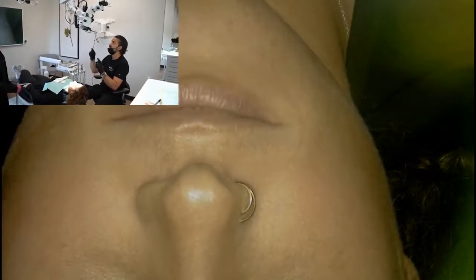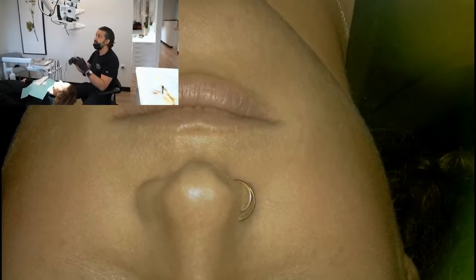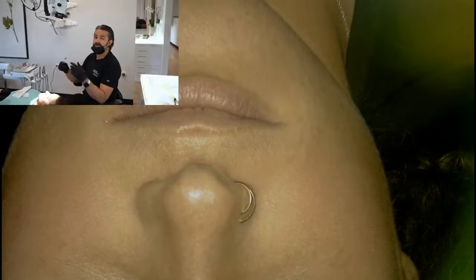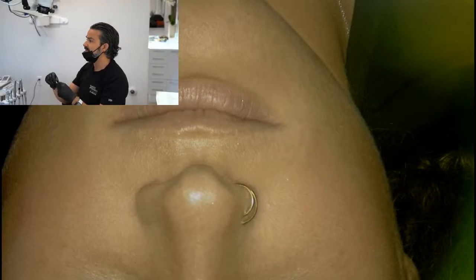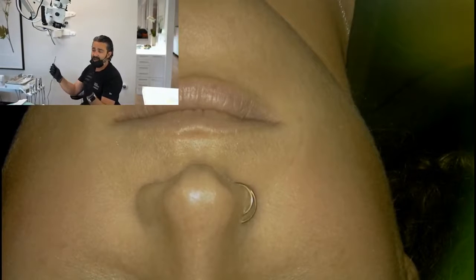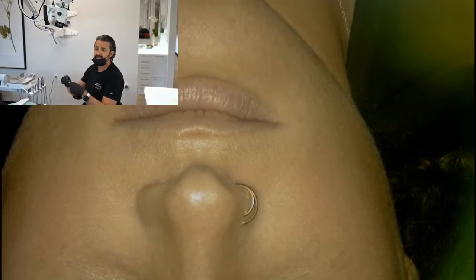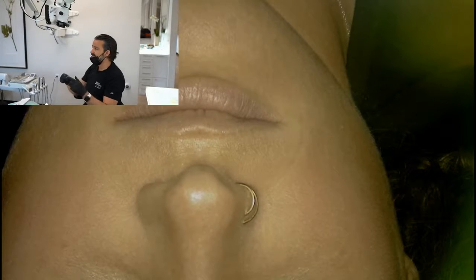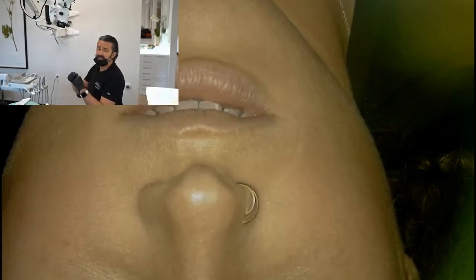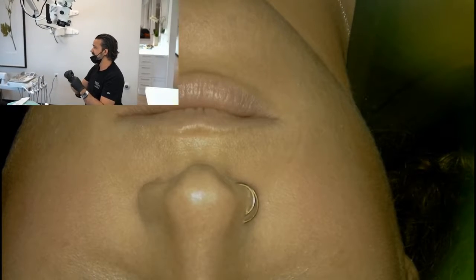I guess to review, when you go back to the ability to have an environment that you find comfortable, it's just like when you build a home, you really need to spend time in your environment and identify, I would say first, how your assistants work around the chair and how you work around the chair. Once you identify that, you pick the scope mount that makes the most sense.